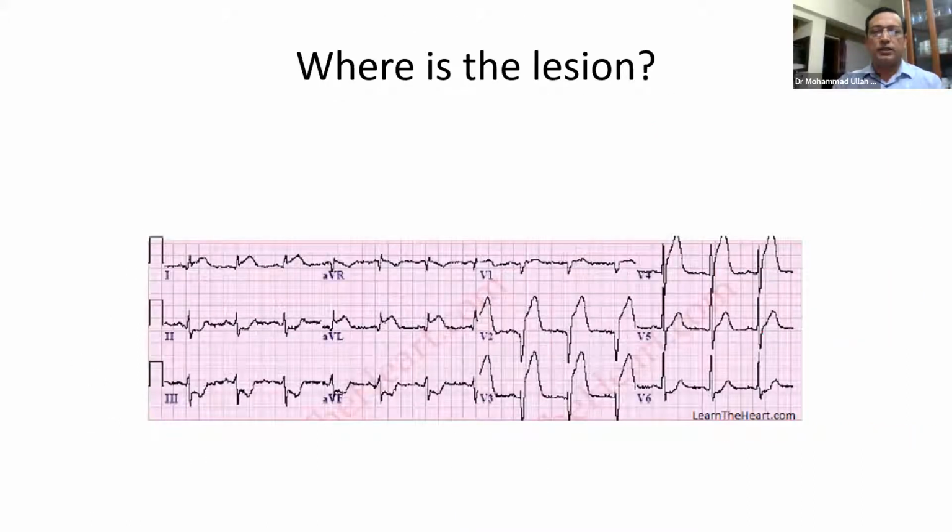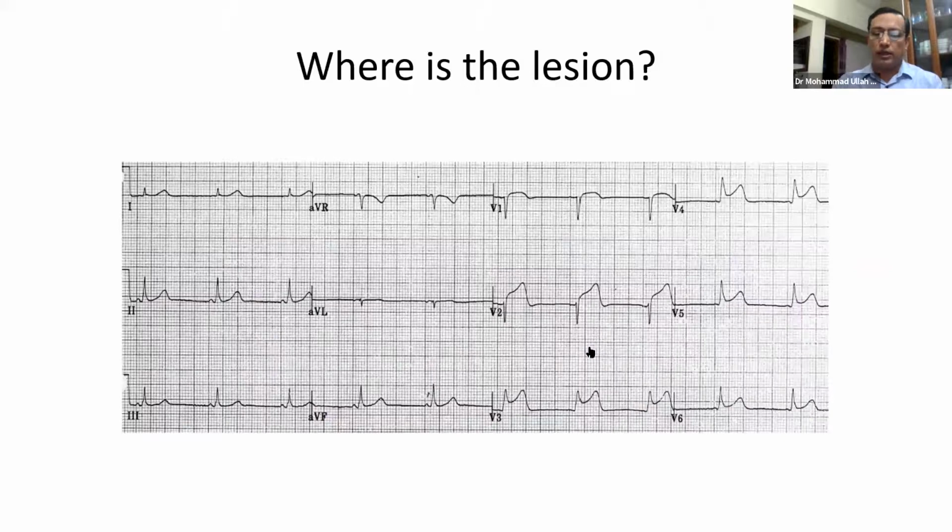And these are the different conditions. Like this one, the patient has got ST elevation in all these leads. There is none in aVL and 1, there is no elevation in aVR, and minimal elevation in V1. Most likely, this patient has got a LAD lesion distal to S1 and D1.